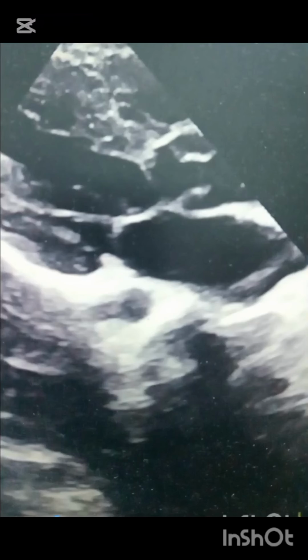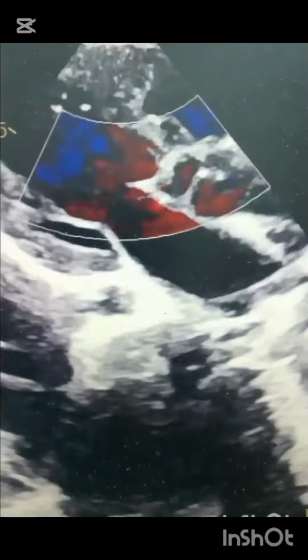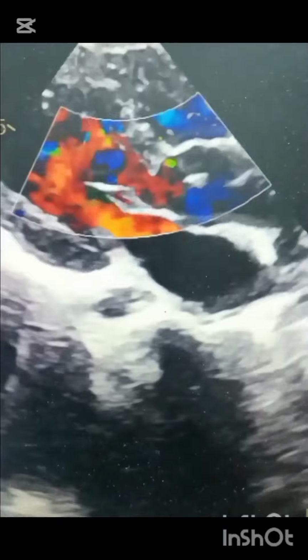Today I have a congenital abnormality case. Have you ever encountered a rare cardiac case where subaortic stenosis and cleft mitral valve exist together? No, I have in this case. This unusual combination can pose serious hemodynamic threats. Today, let's break down these complex conditions with echocardiography examples and clinical insights.